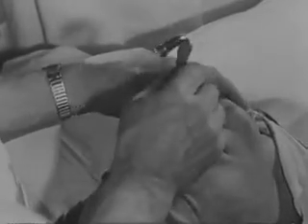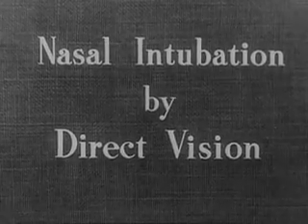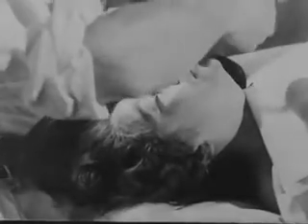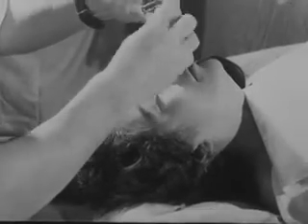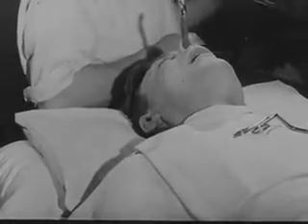Here again, we repeat the blind intubation done at normal speed. If the tube does not go in readily by the blind method, the anaesthetist should on no account continue prodding. Inexpert intubation and the use of force instead of skill are likely to result in trauma. This is a potential disadvantage of endotracheal anesthesia, but it is avoidable. In a difficult case, the anaesthetist should resort to the laryngoscope and forceps.